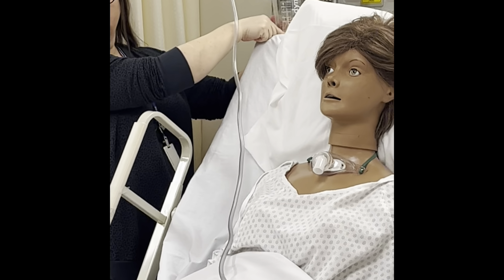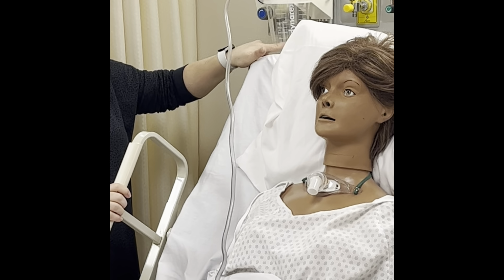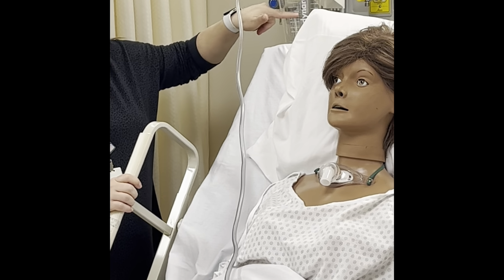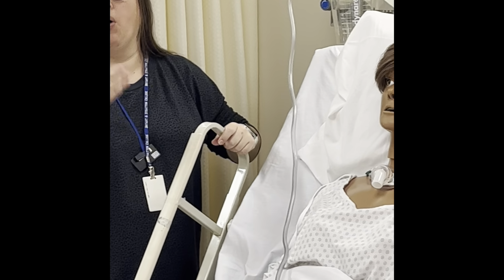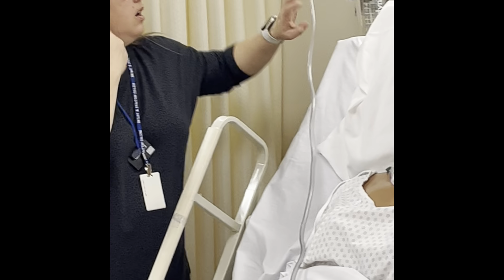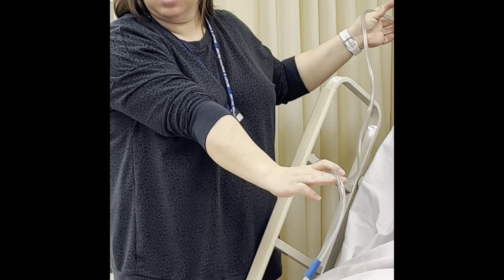On the side, there should always be numbers. And usually if this patient was getting decompression, we would put a piece of tape down here and we would mark the levels until it got higher. And why we're doing this, because we're seeing how much is coming out of the stomach. Does that make sense? Then there should be a tube off of it that would go to the patient.